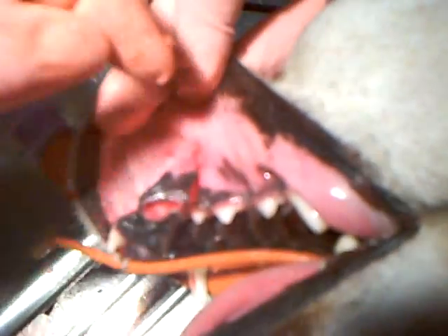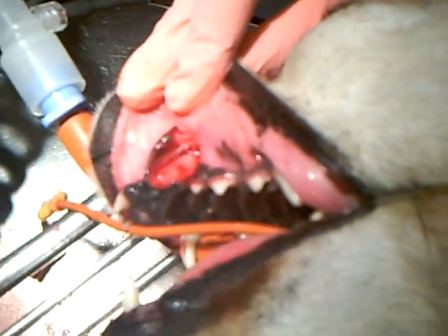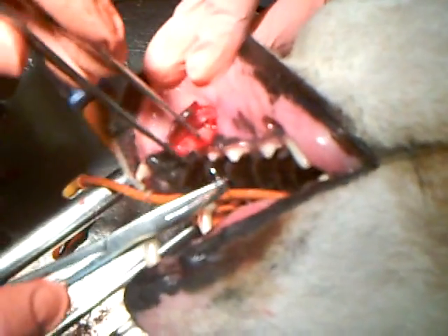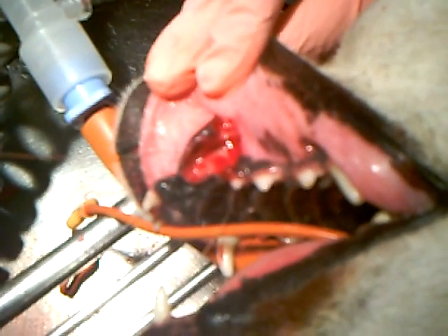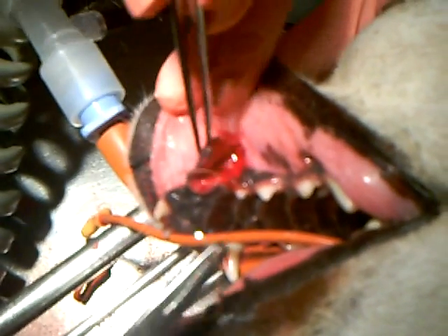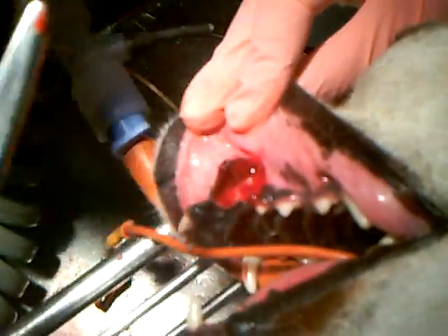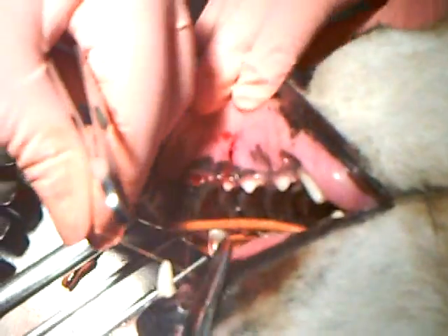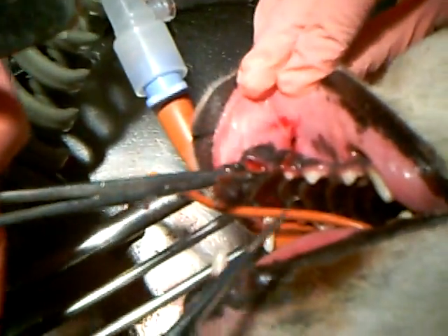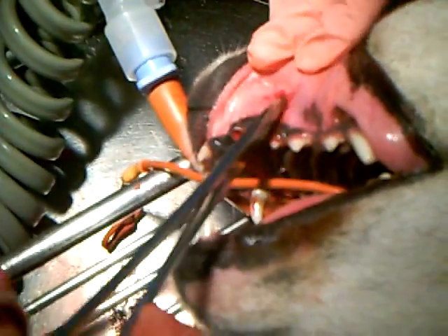Now that we have the tooth removed, what we're going to do is suture this gum tissue back into place. After I took out the tooth, I flushed out the socket really well and cleaned up any edges of sharp bone. So we want to place this gum tissue back where it was originally and just put a couple throws in there. That starts at the beginning of the suture track, and I'm going to follow it all the way up where the incision went.